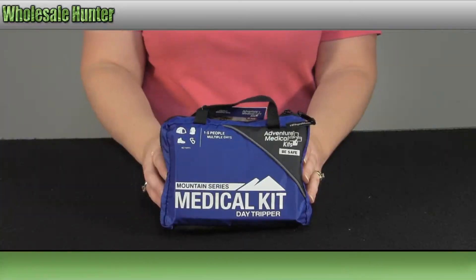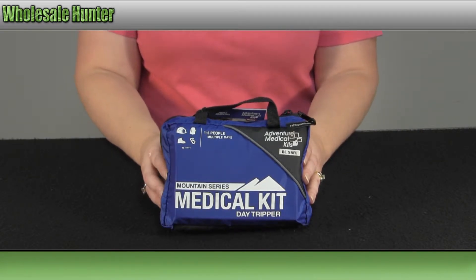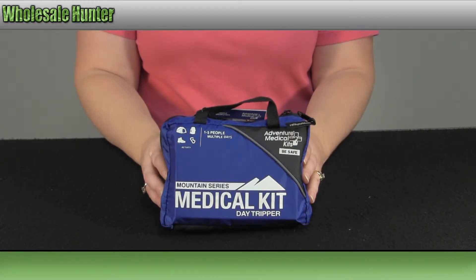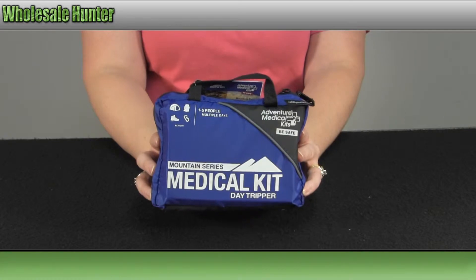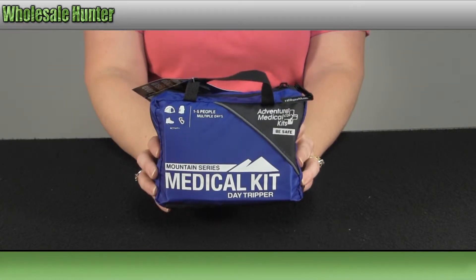Hello and welcome to the unboxing video for the Mountain Series Medical Kit, Day Tripper Edition, made by Adventure Medical. Manufacturer number 0100-0116. This is how it comes in its own convenient storage carrier.